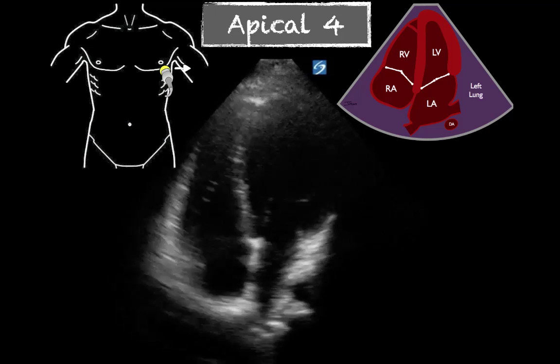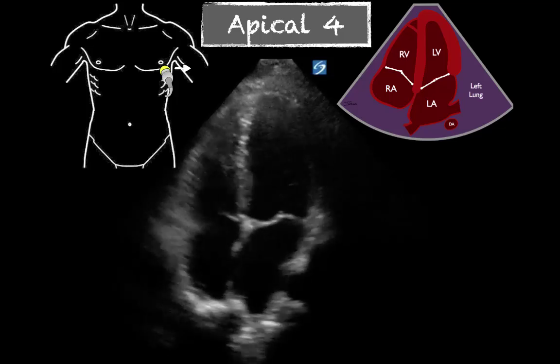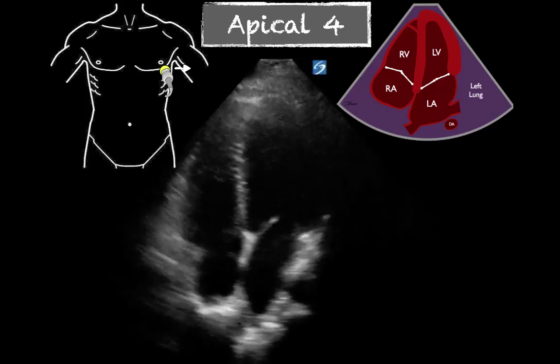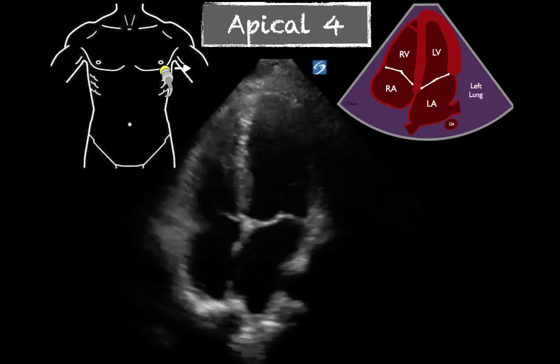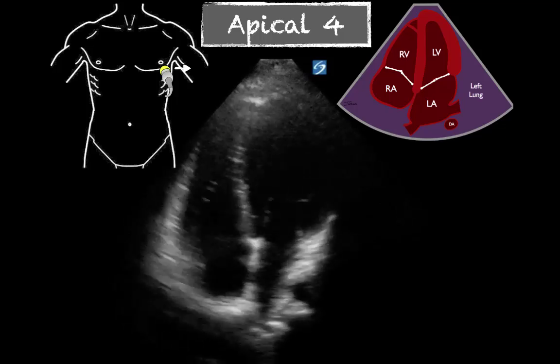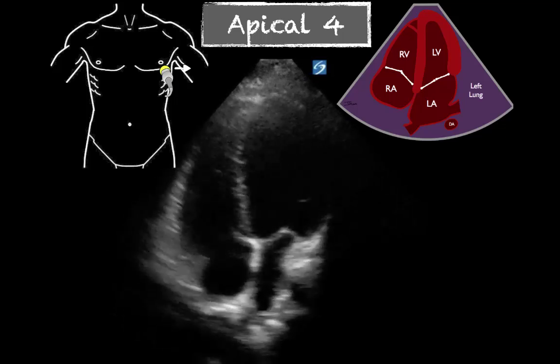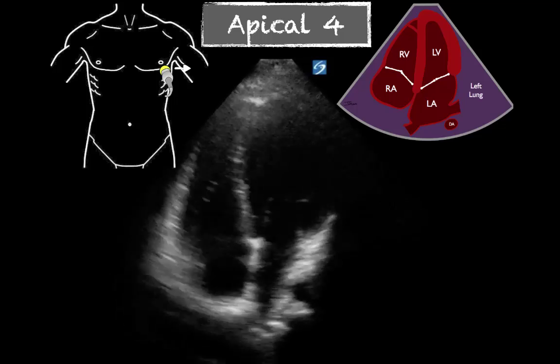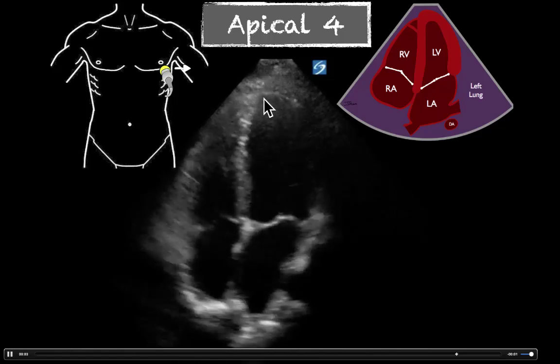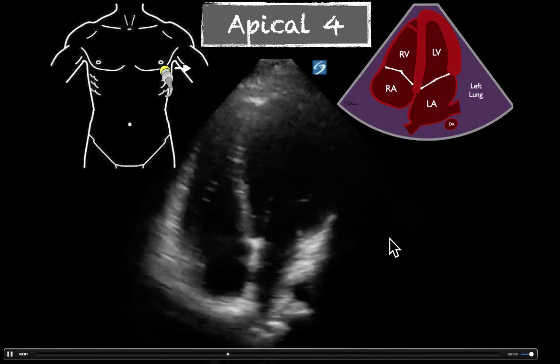We're going to look at this example here. Refer to the diagram in the right-hand corner so that you can get your anatomy down. Remember that we're going to put the probe in about the true nipple line on the left and feel for that PMI. If you can't feel it, set it right inferior to the true nipple. In women, it's best up under the breast fold, and we're going to aim back towards the manubrium. We want to get it right at the apex of the heart, and we want to get all four chambers in plane. By finding the mitral and tricuspid valves, we know we're in plane.